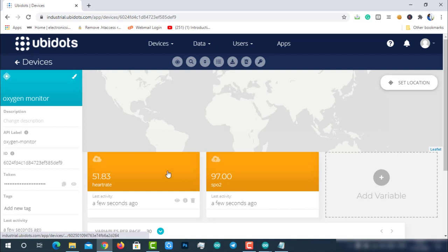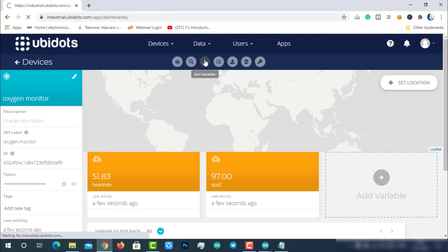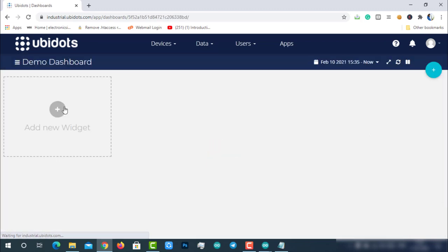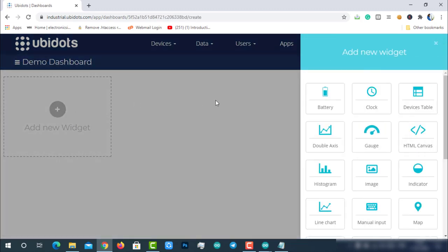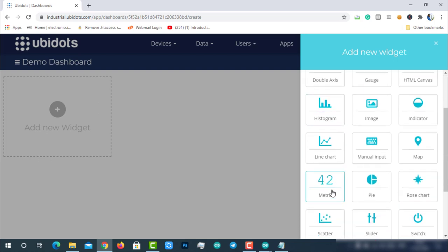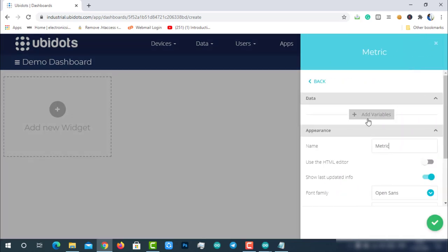Currently, we are receiving and storing data on Ubidots. Now let's visualize the same data. For that, choose dashboard from the data dropdown menu. Click on add new widget. You will be prompted with a bunch of data visualization options. Choose one among them.